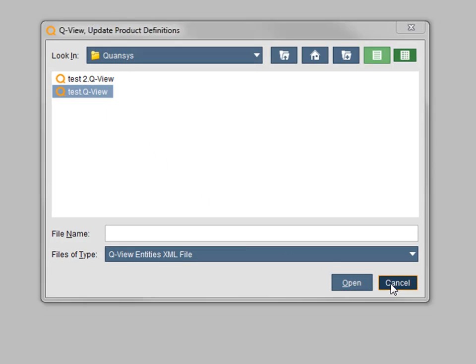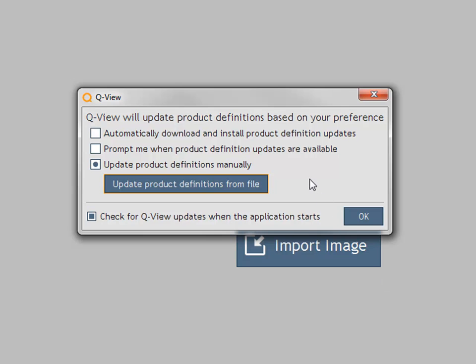If auto updates are not occurring after they have been enabled, check to ensure that Settings, Administration, Network settings are correct. If your PC does not have internet access, contact QUANSUS at 1-888-QUANSUS to arrange for software updates to be sent to you.